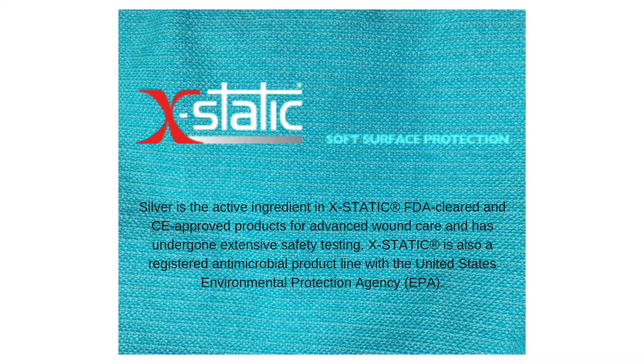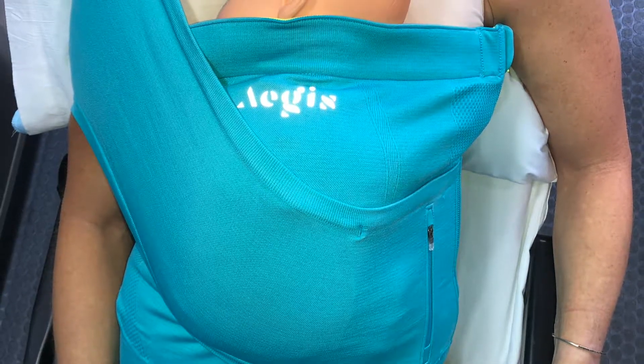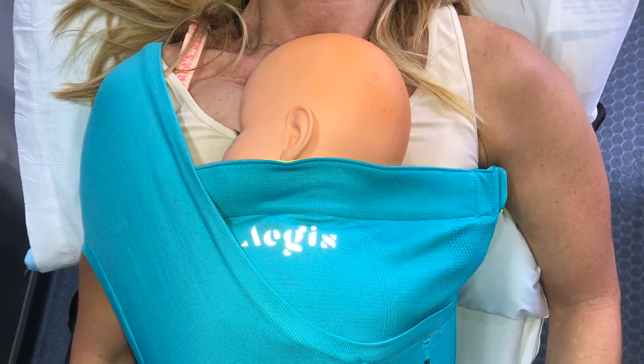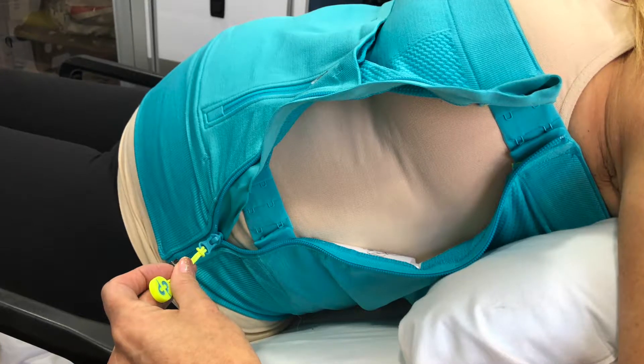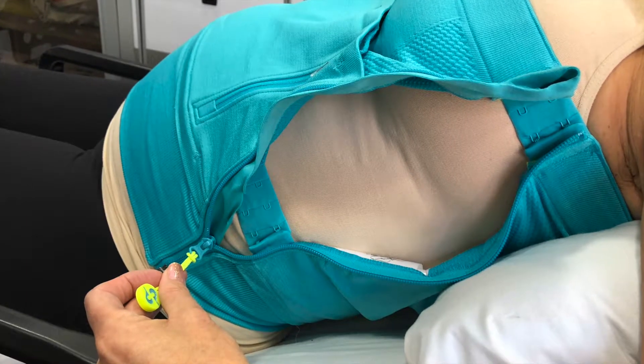Key features of the Aegis Neonate Wrap: elastic silver thread woven throughout provides thermoregulatory properties to help maintain newborn's optimal body temperature and help reduce the risk of hypothermia during transport. The NanoGuard across the top provides neck and head support. Newborn's face is visible to the transport team. The zipper and two sets of i-hook fasteners on the left side provide quick access.